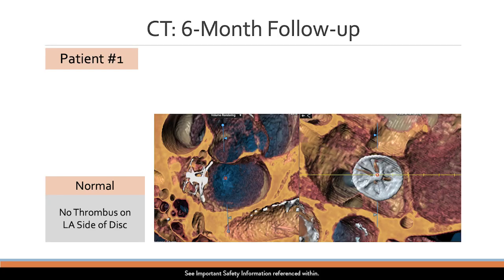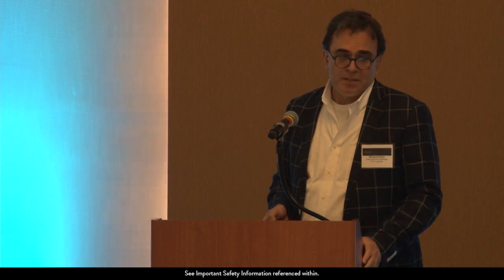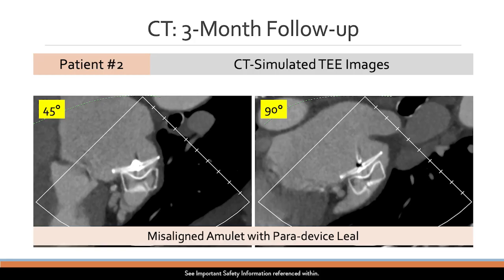Okay, and how about this? This is a CT view from inside, sort of a 3D zoom view. Again, I want to point out that there is also that letter X artifact that you have to look at. But sometimes you have to be honest: not all pictures are nice. Is this a leak or no leak?